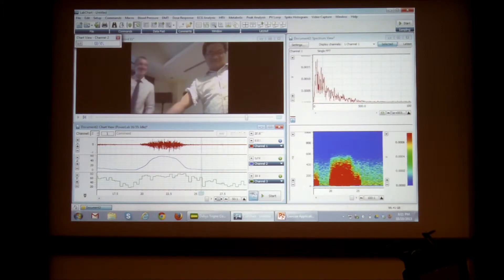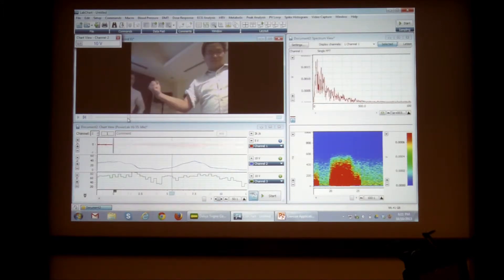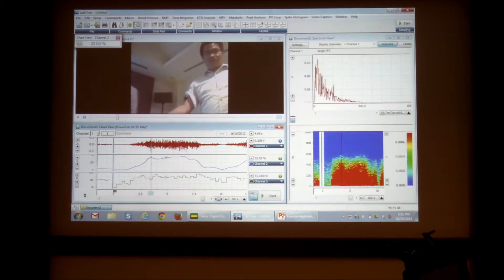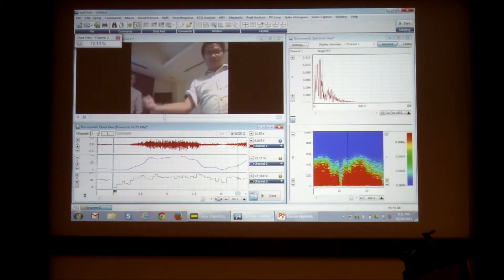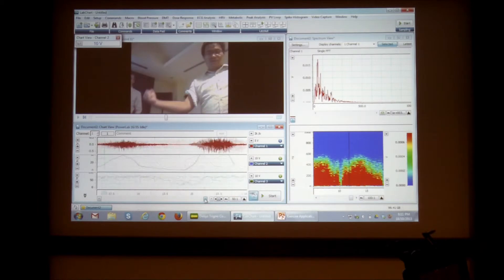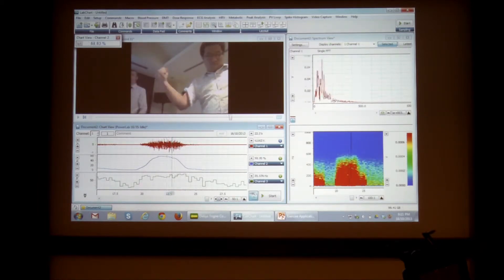So you can always click through the movie and it scrolls to the lab chart, or you can click in the lab chart and see exactly what was happening in the movie.